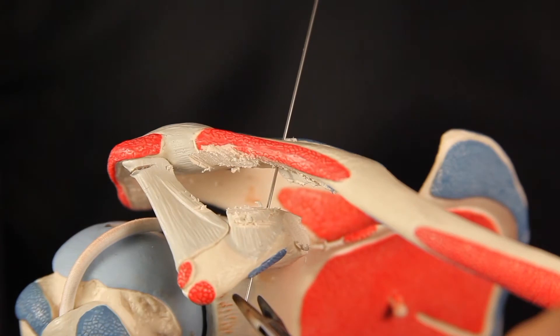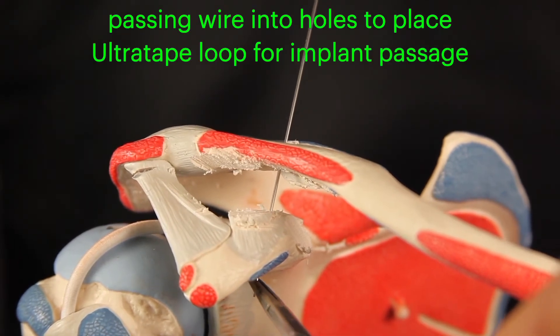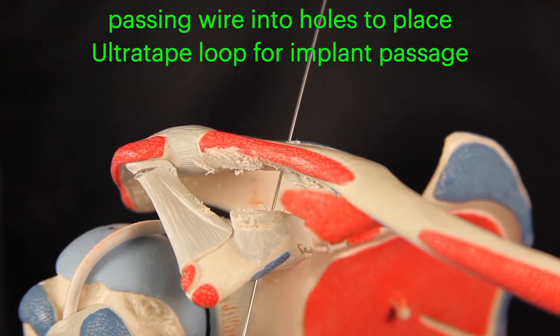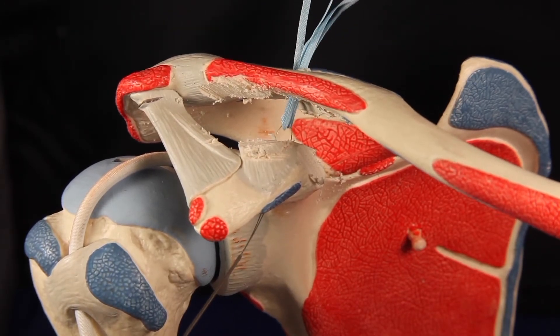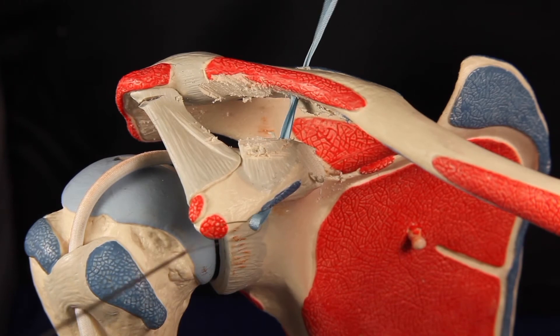A wire loop is then passed through both drill holes and retrieved underneath the coracoid. A folded ultra tape is passed into the loop at the end and pulled out, creating a retrograde loop for passing the implant.